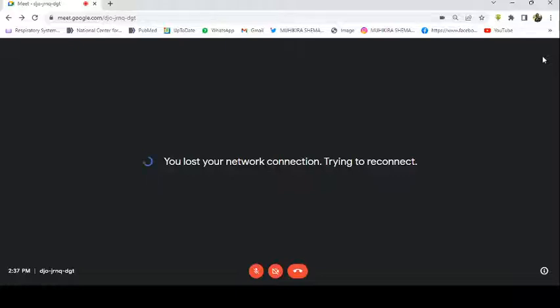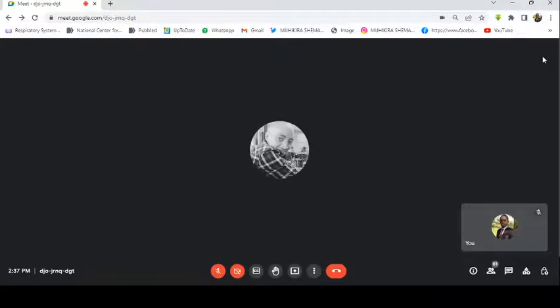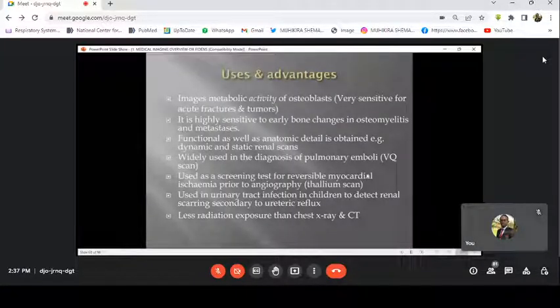how an organ is functioning mostly. So, let me give an example for pulmonary embolism. For pulmonary embolism, there is a scan called ventilation perfusion. You give a patient a nuclide in the vein, and another one is inhaled. In the area where it is not symmetrical, maybe the contrast has gone there, but from the other nothing is going there, you say, this means something.